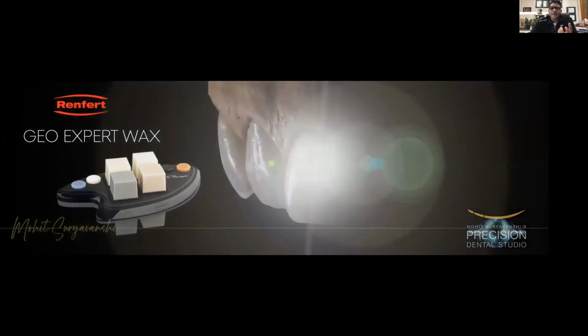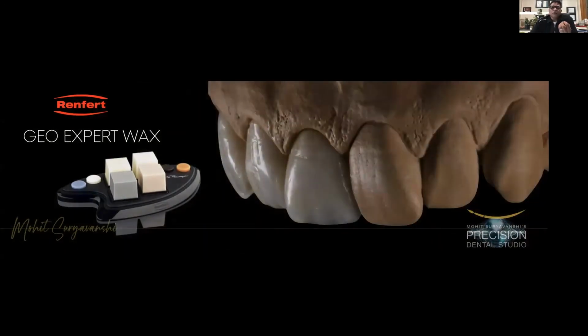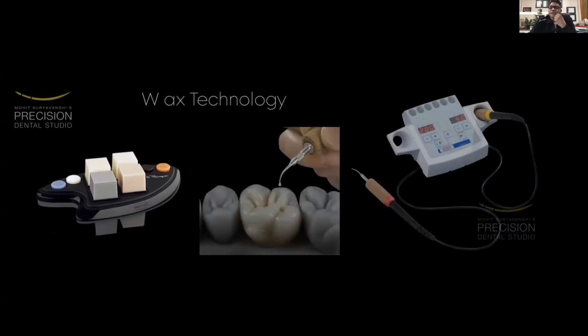And for that, the more materials we can get in terms of wax, this is the new Geo Expert wax, the August Bruguera set, which not only allows me to study the shape, but also gives me an understanding of the final color. We can have all types of nuances added just the way we add into the ceramics with this wax set. It's a real pleasure working on that.